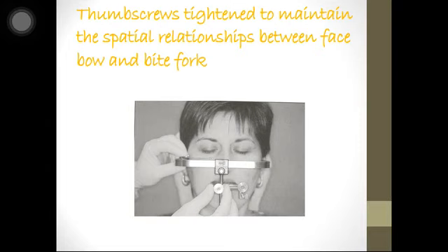Now you can see that first the position of the maxilla was recorded, then the posterior reference point or the hinge axis was recorded, and then they both were joined together, and that's how they are related. The base of the skull, or you can say the hinge axis, is now related to the maxilla. The maxillary position is recorded in comparison to the hinge axis of that patient.